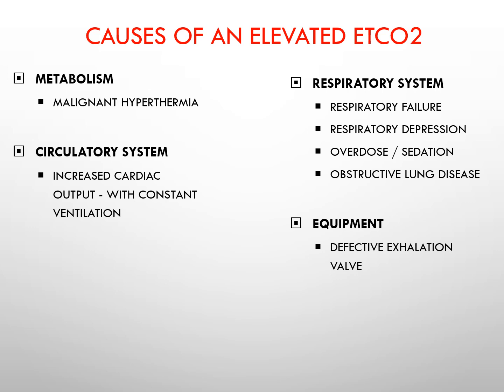Overdose or sedation, so an accidental overdose or illicit narcotic use, or just sedation when a patient is given moderate sedation to facilitate a procedure. And an obstructive lung disease I referred to a little bit earlier, whether it's COPD alone or you have something superimposed on top of it like a pneumonia.